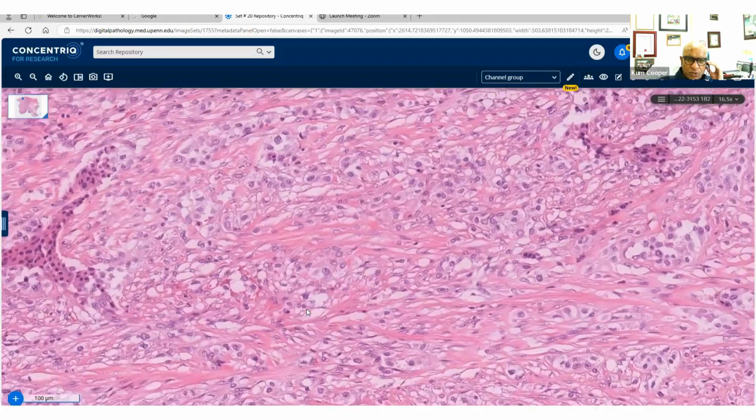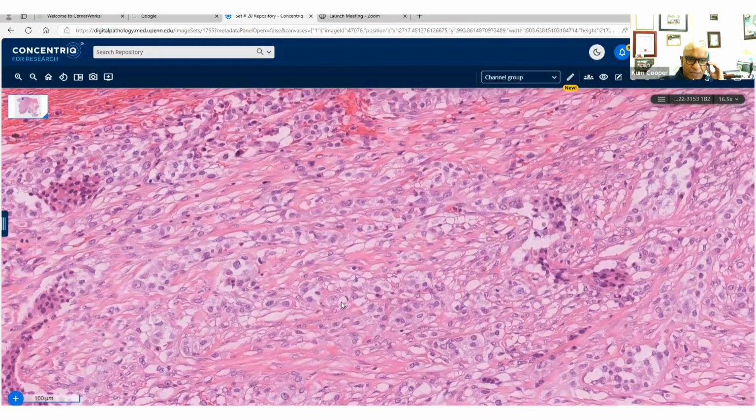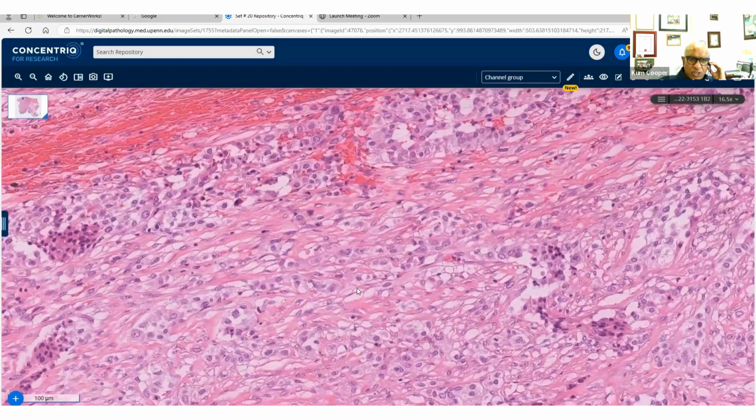In my approach to tumors that I'm unsure of the diagnosis, I like to rule out melanocytic, and I embark on a small screening panel of melanocytic markers. Even though S100 and SOX10 are not truly melanocytic, they encompass the nerve sheath tumors as well. That's my second stop.